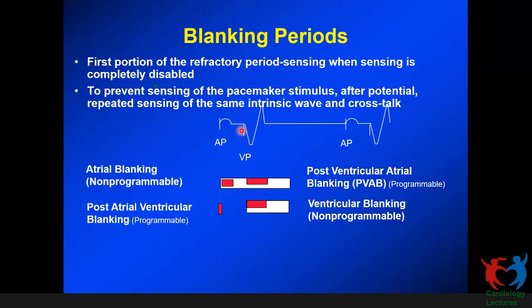And then here on ventricular pacing, there is a ventricular refractory and blanking. And in the atrial channel, it starts PVARP, which we discussed. And in order to avoid oversensing the far field R wave or even the crosstalk, there is a programmable blanking here. So these two are cross-chamber blanking, and then these are the same chamber blanking. In the current pacemakers, usually the same chamber blanking are not programmable, which automatically adjusts. The cross chamber blanking are usually programmable.